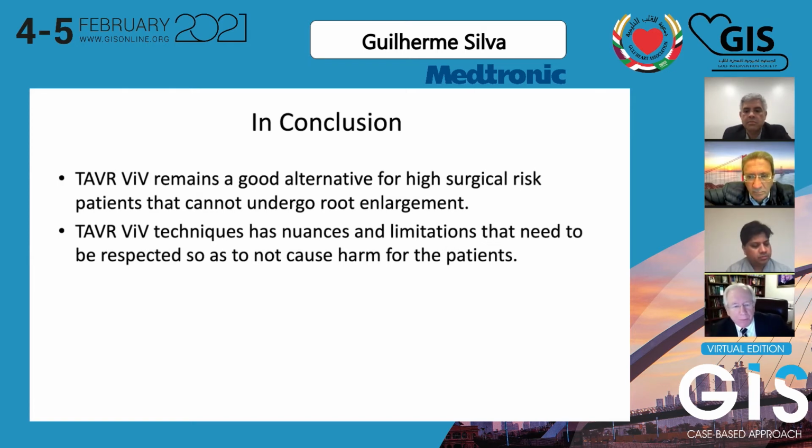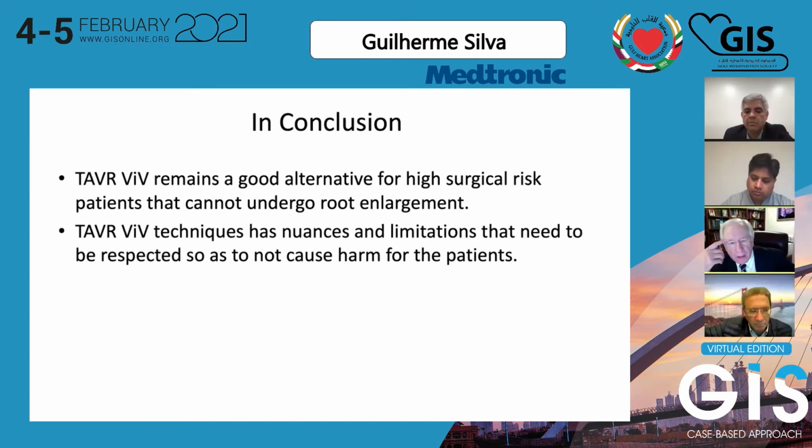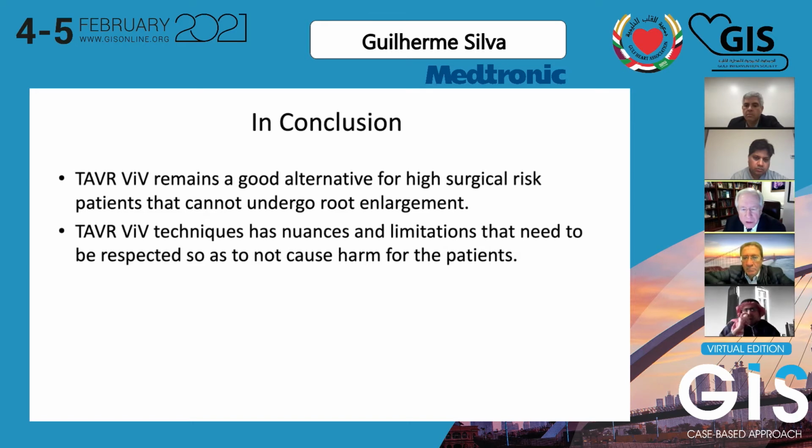And I'll take an example. This last patient had a tortuous aorta and some concerns about the size and calcification of the iliac artery. And we obviously chose to go up the left side. But this particular device has a sequential balloon and valve that, once you're in the descending thoracic aorta, you take from a sequential position back into a coaxial position, which allows for a lower profile. So for certain valves such as this, where you want to do some fracturing, I thought it's an excellent choice.